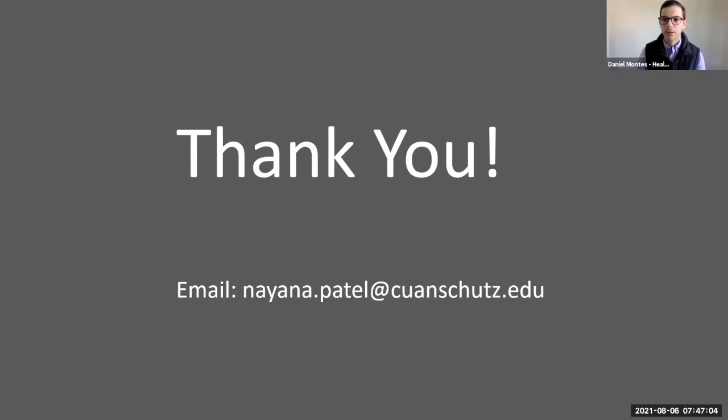Thank you. The next question is, what is the role of PET in the diagnosis of prostate cancer? Okay, good question. This is a little bit out of my specialty, but I can tell you that for the PET scan, there are several new tracers, like choline PET, PSMA, which is prostate specific membrane antigen PET scan. Then there's Axumin PET scan.